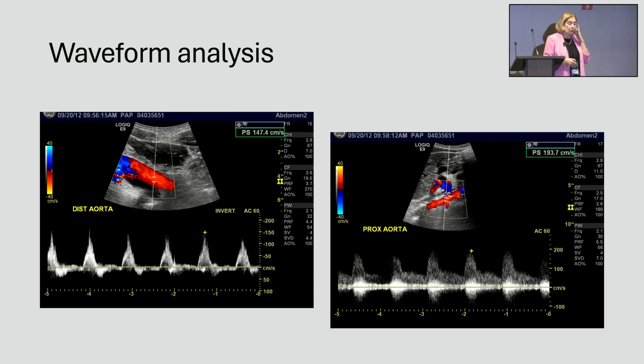You may hear a little bit of turbulence, which could be anything, tortuosity or nothing, but this one is absolutely leaning. That leaning over, I always call it the drunken lean. It's just slow getting there, and it's leaning to the side. That should tell you to go up, go more cranially.